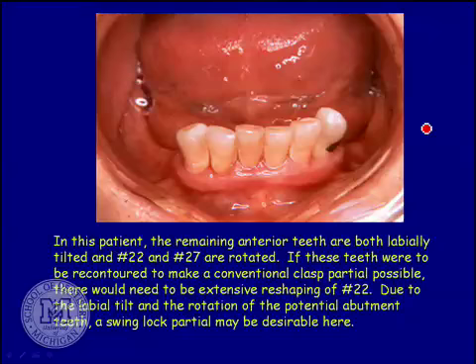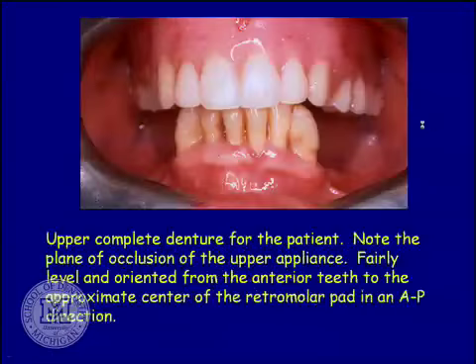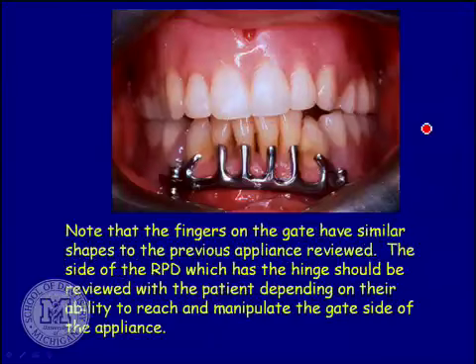So here's a Swinglock. Again, we don't need to do these so much anymore because nowadays with high-speed instrumentation and bonded composite materials, I can alter the contour of these teeth to make them more favorable fairly easily. So if you'd see these used at all, they would tend to be used in maxillofacial situations for the most part. And you say, golly, these are ugly.